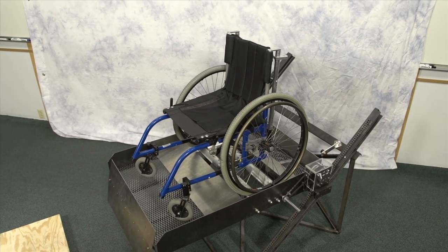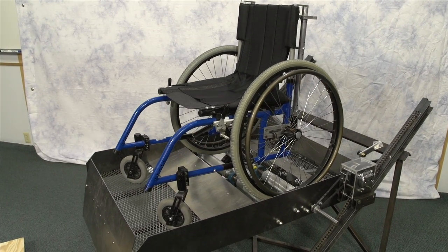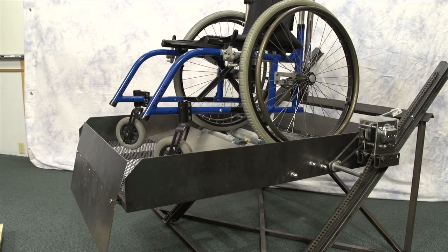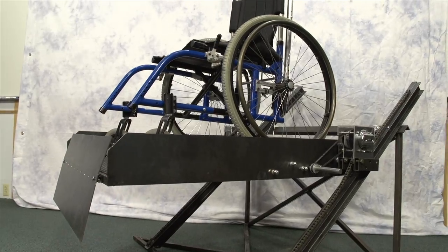We wanted to provide an alternative solution for wheelchair users, so we focused on combining the benefits from both of these previous systems while avoiding their drawbacks, and designed the funicular to be a self-powered, safe, compact, and inexpensive device for the consumer.